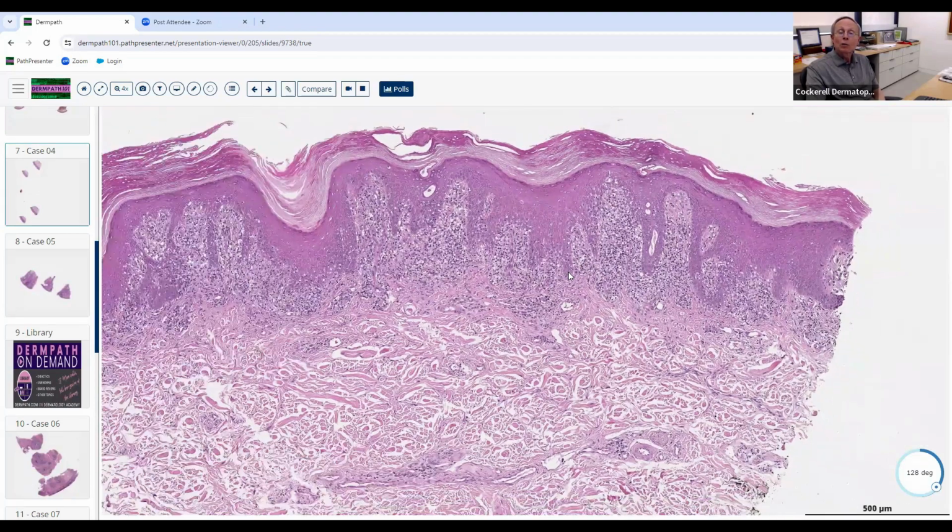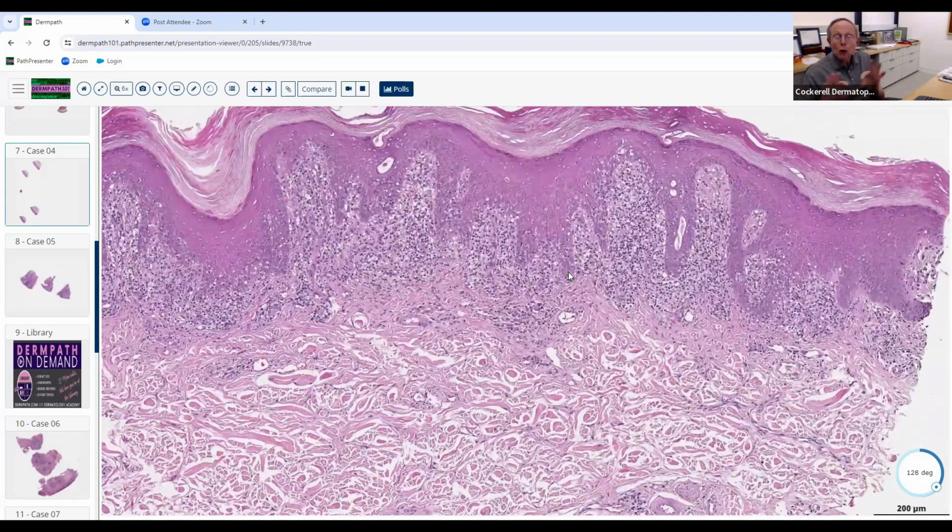So basically, that's mycosis fungoides. It's just purely in the epidermis for the most part, sucking it into the epidermis. It doesn't go anywhere else. It's often on volar skin too. So that'd be something to think about. Maybe Langerhans cell histiocytosis. Maybe throw that in there because they're clearly not all lymphocytes. So those are just some things to think about.